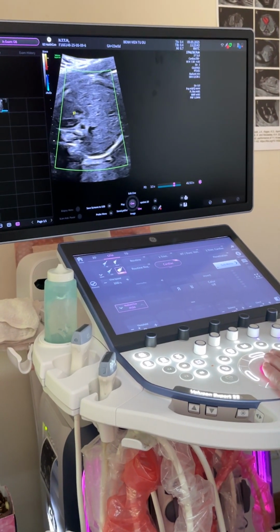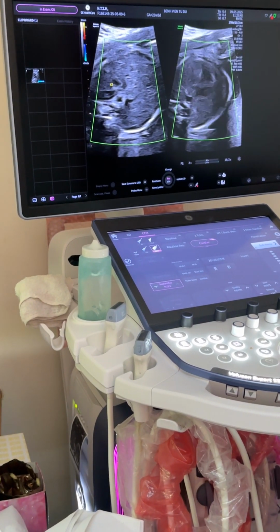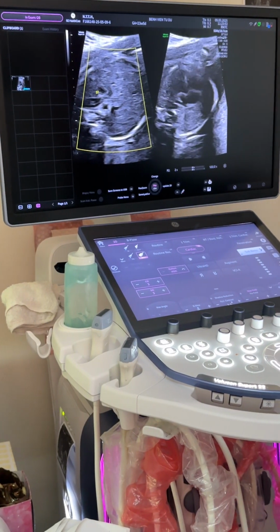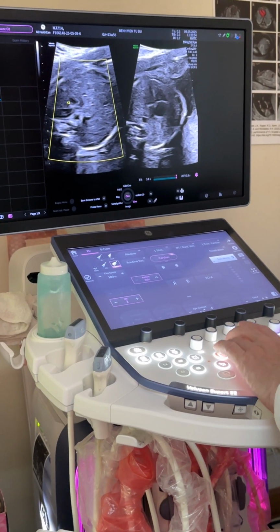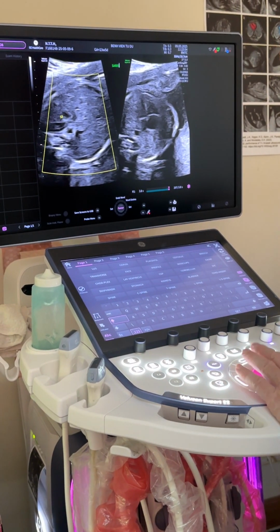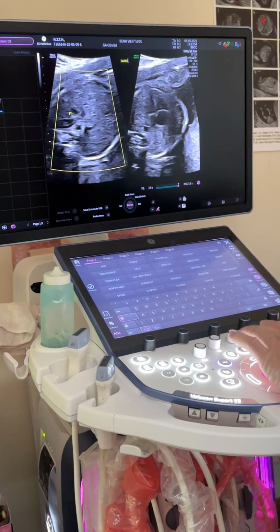So I have to update that, and then I split the image, and then I come up to look at the four-chamber view of heart. I first of all do this in 2D. So the first thing in working out with 2D is the size, axis, rate, rhythm, and situs. Okay. So I know the stomach's on the left-hand side, it's small. The heart is on the same side.